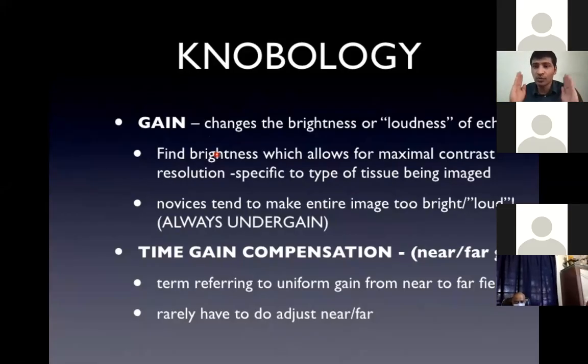So you should do the ultrasound in a completely dark room and minimize the gain as much as you can, because the lower the gain, the clearer the image. If you increase the gain, the image looks white, but it's not that clear. So we have to understand the importance of gain. Sometimes, if we are doing ultrasound in a very bright area, you have to increase the gain to see it, but it makes the image a little less clear.